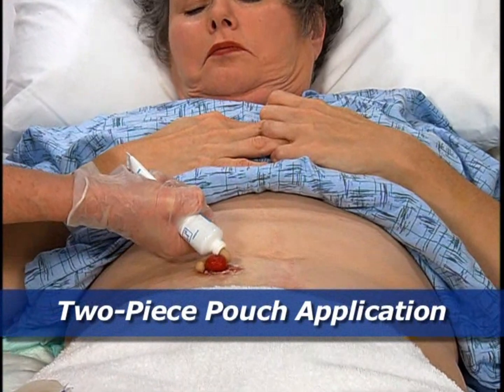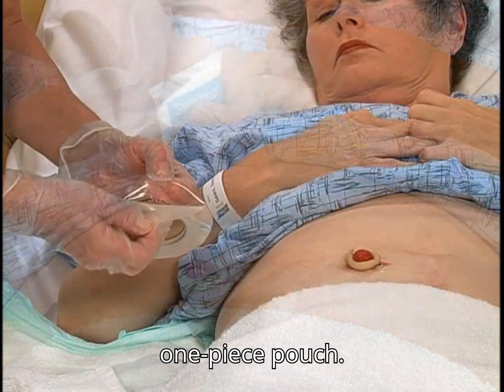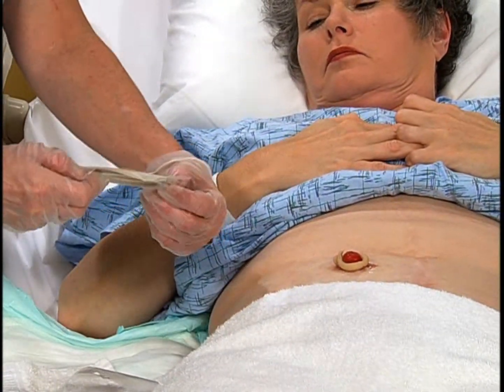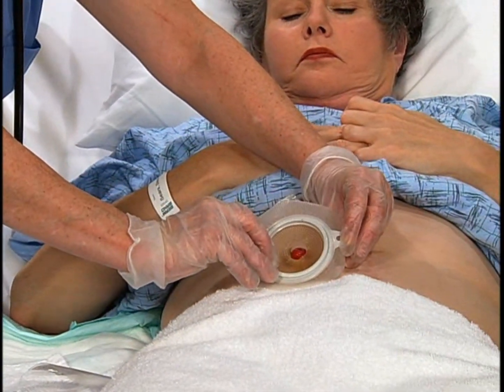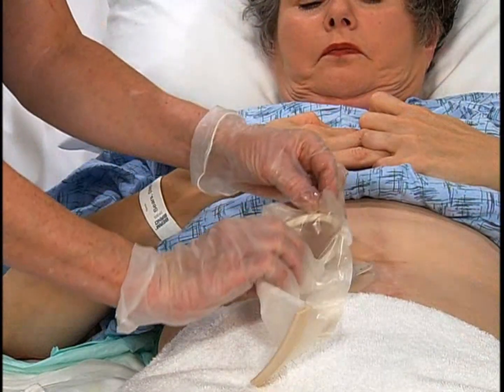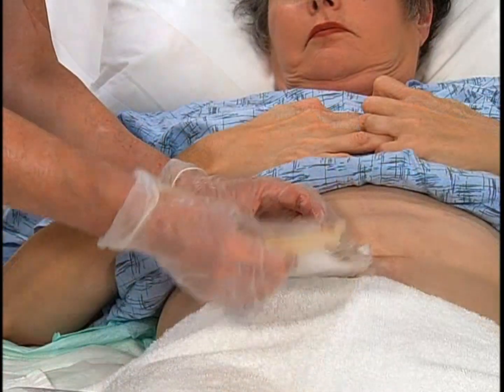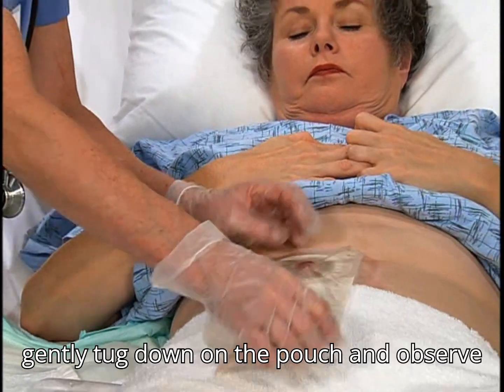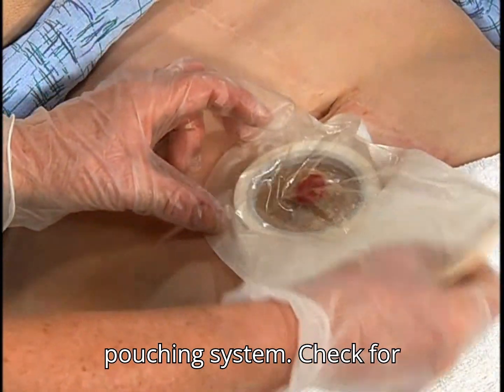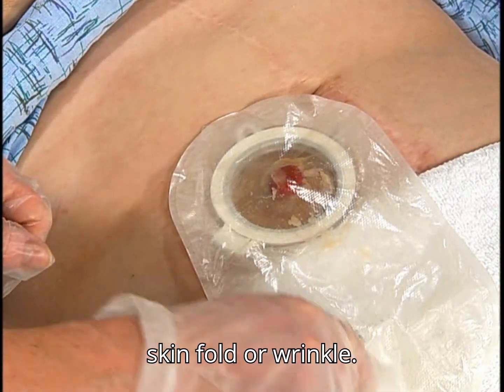For a two-piece pouching system, apply a barrier paste flange as you've just seen for the adhesive backing on a one-piece pouch. Then snap on the pouch. For either type of pouching system, gently tug down on the pouch and observe the integrity of the skin barrier and pouching system. Check for effluent tracking under the edges of the pouch, which may indicate a leak due to a skin fold or wrinkle.